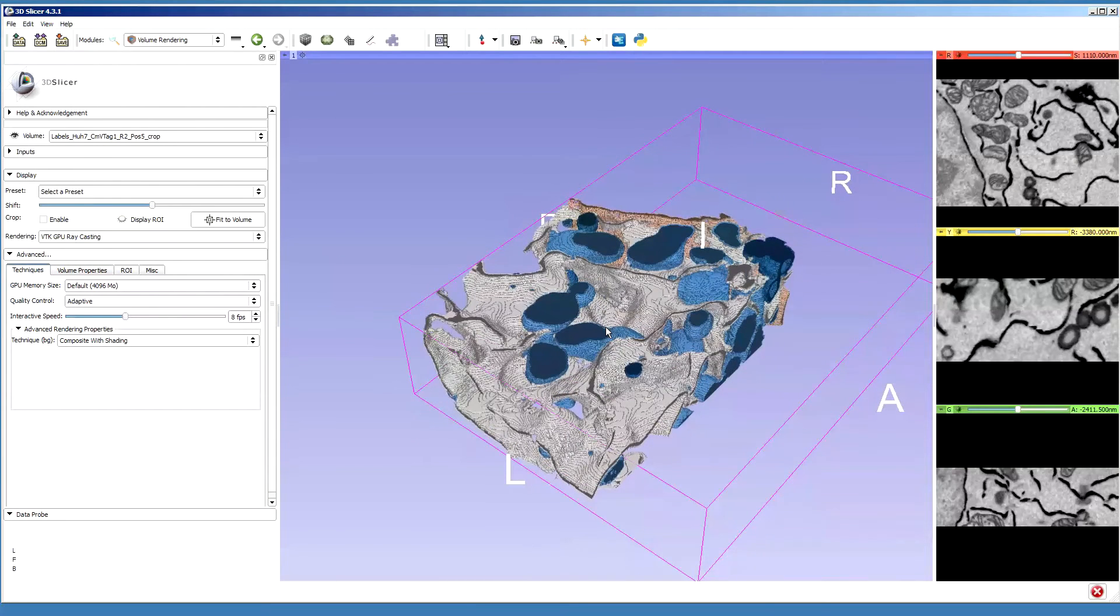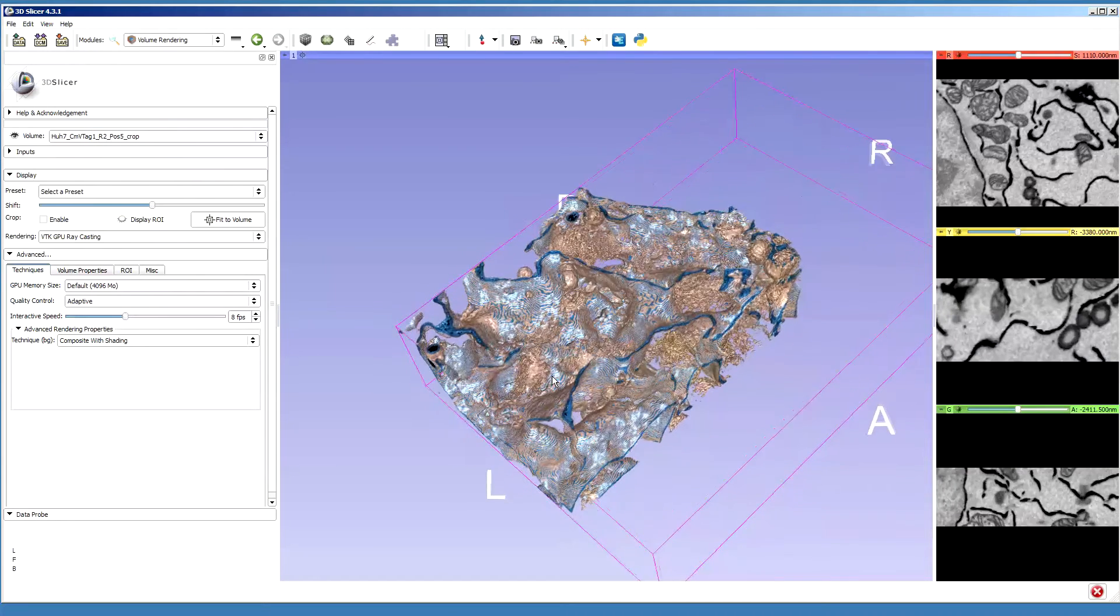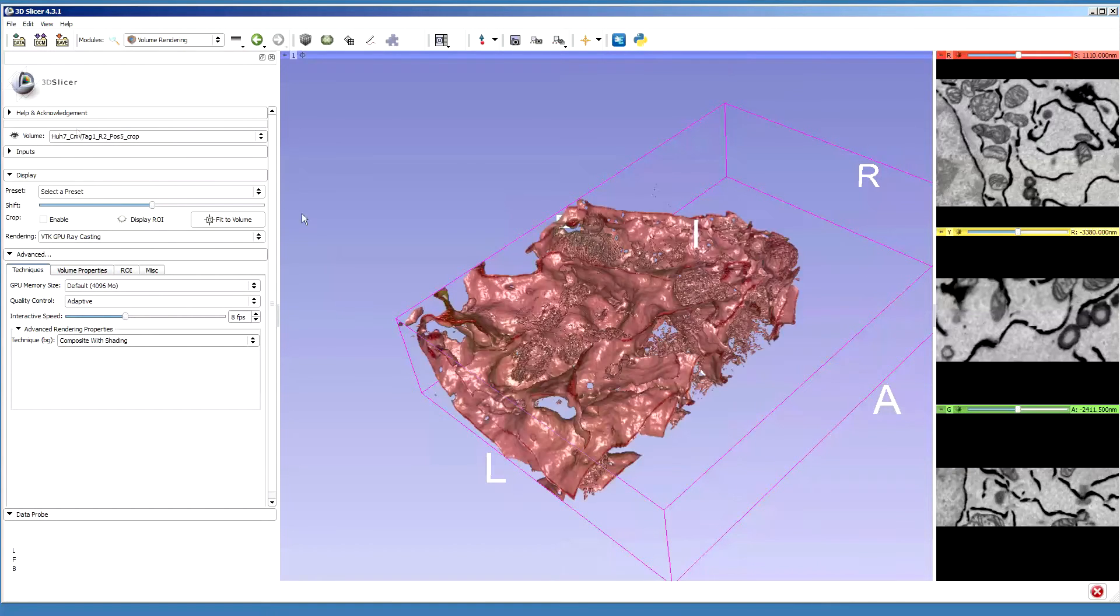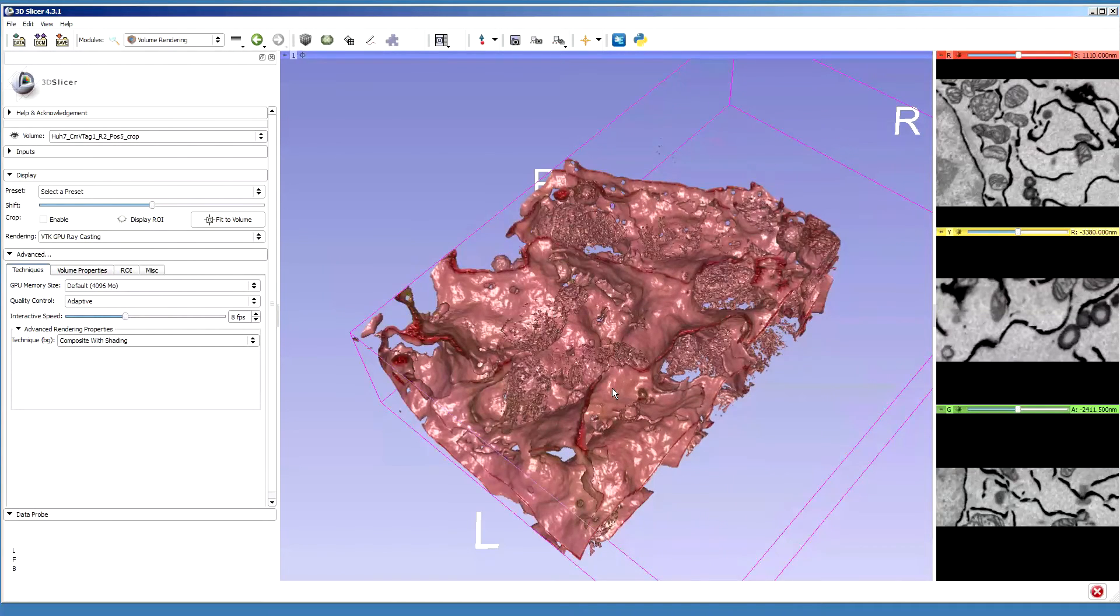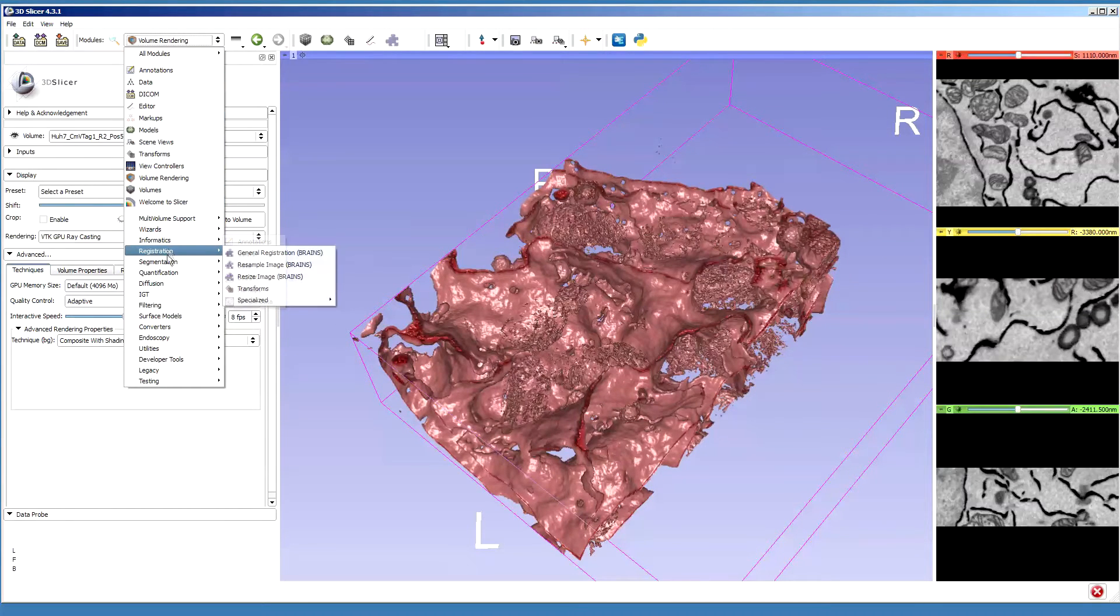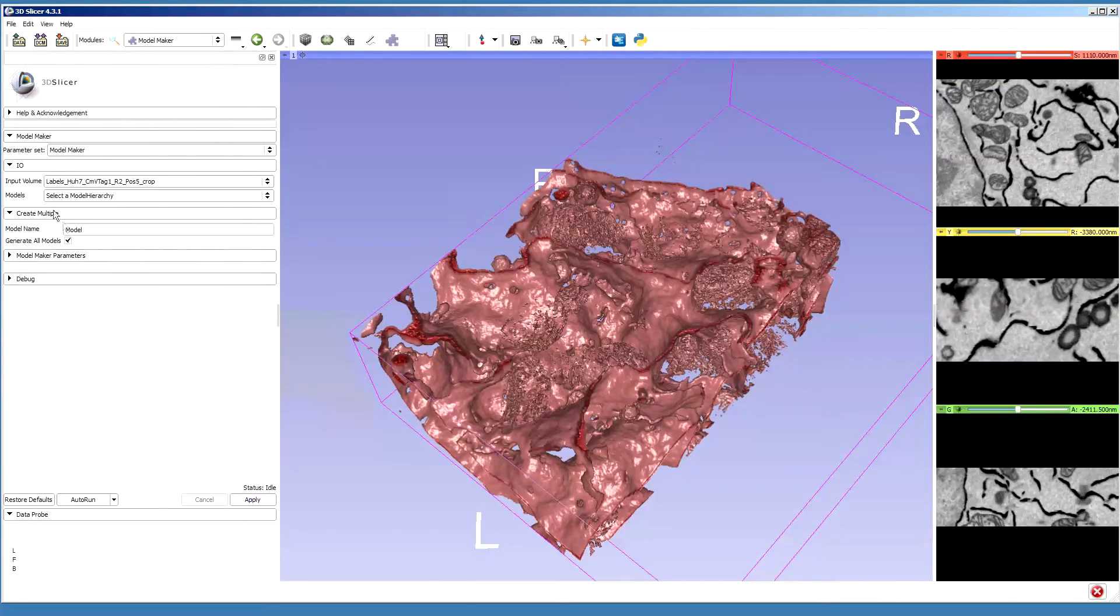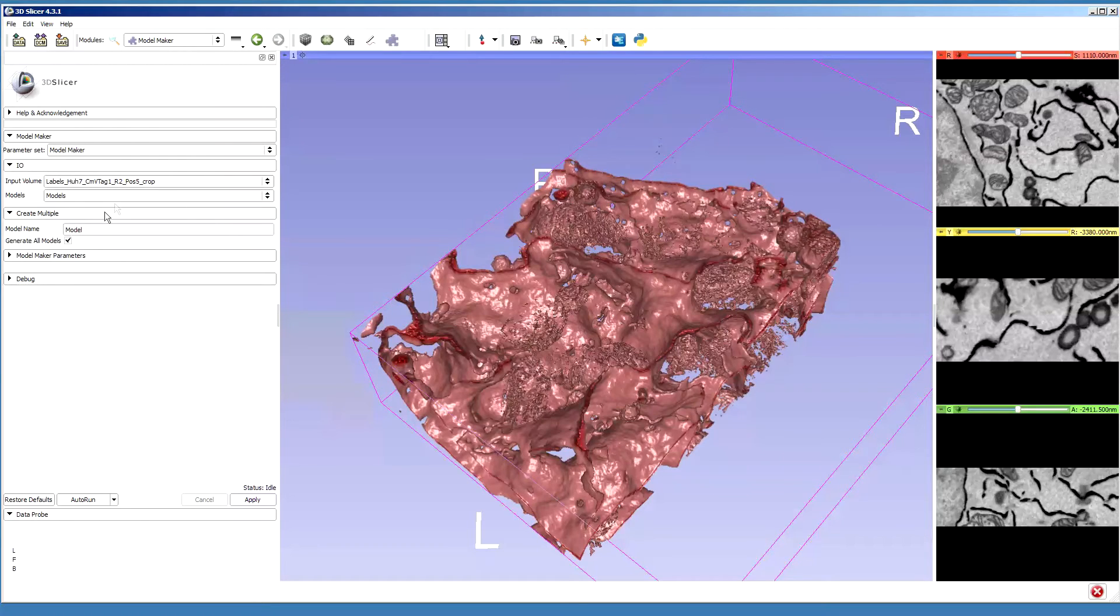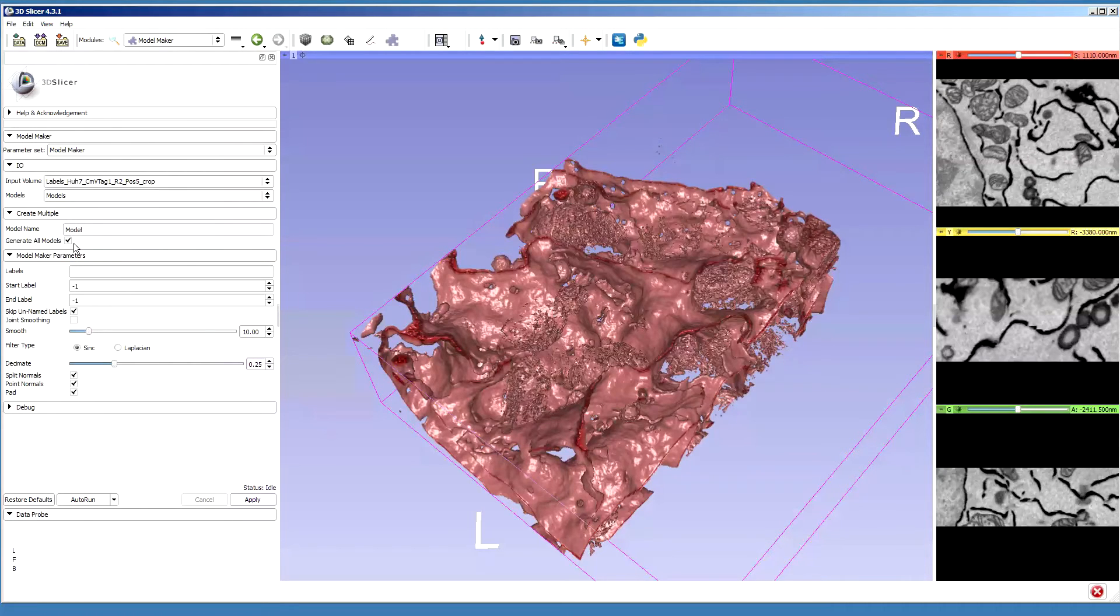Now what we'll try to do is use the labels to generate a surface model. For that I need to get into the surface models menu and model maker. Then in this model maker I select the labels, the one I use to create a model, and create new model hierarchy. There are a number of options. I can generate only one material or I can generate all. Let's generate all the models and press apply.